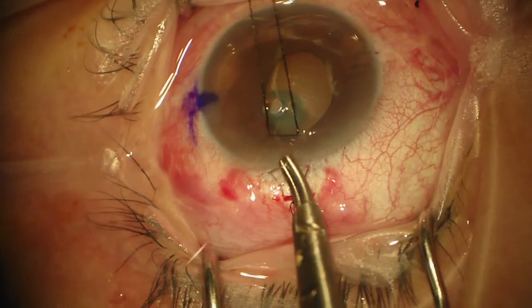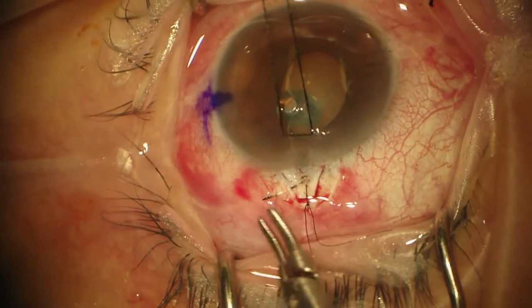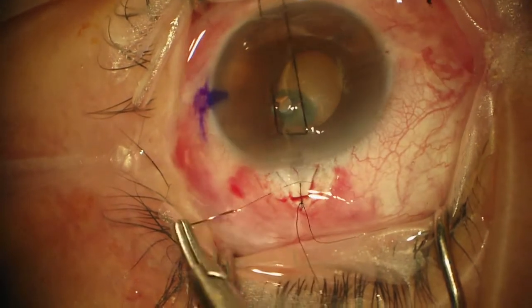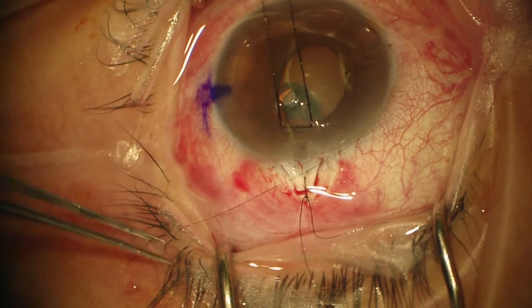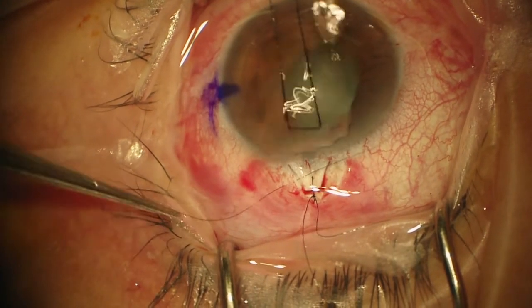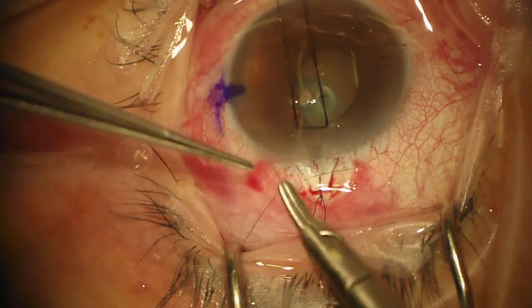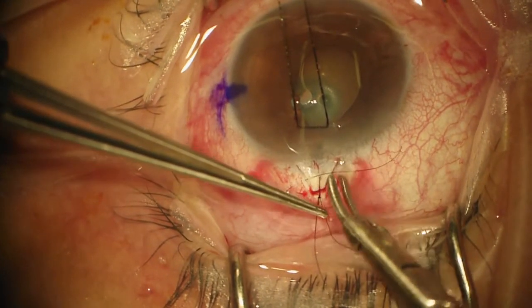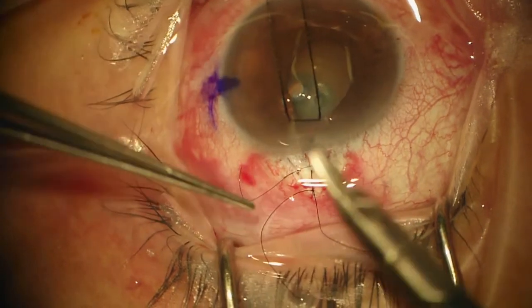Because we have access to a diode laser for suture lysis, we're going to put in permanent sutures. The slipknot again — a single pass, then you go under there and around the back. Grab, keep your needle holder hand steady, and slide your other knot on top.